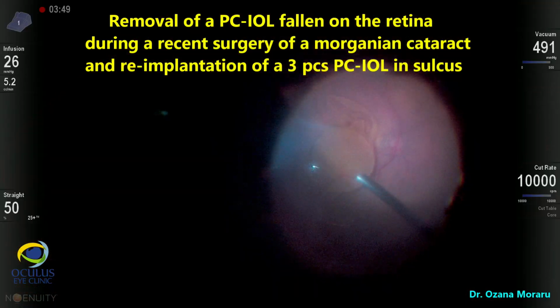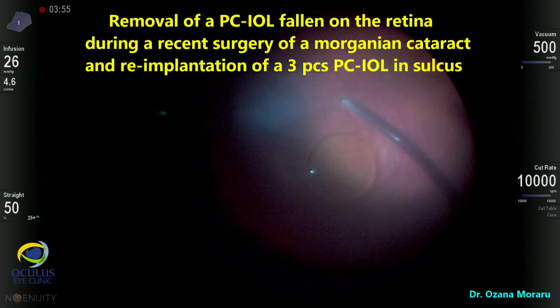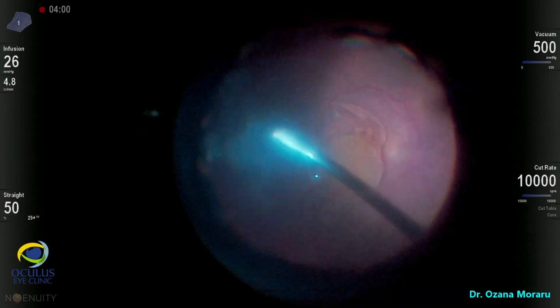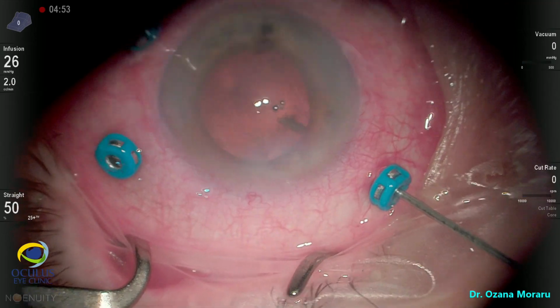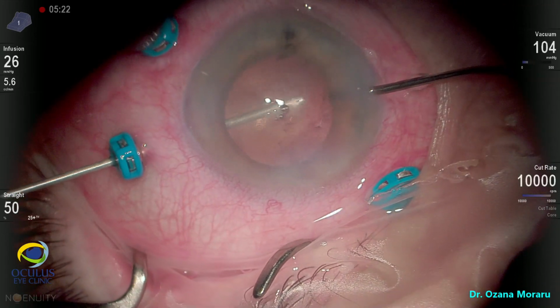This is an 87-year-old lady who was referred to us by the surgeon who performed the cataract surgery one day before. It was a morgagnian cataract, but the surgeon had a complication, posterior capsule rupture during IOL implantation, which was followed by the IOL dropping into the posterior segment.